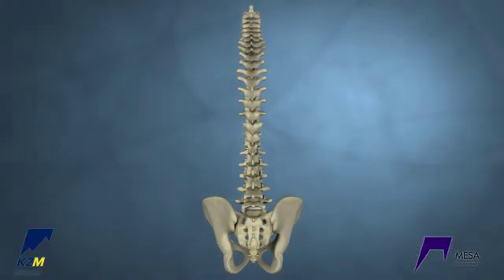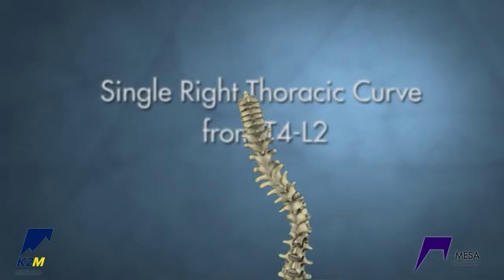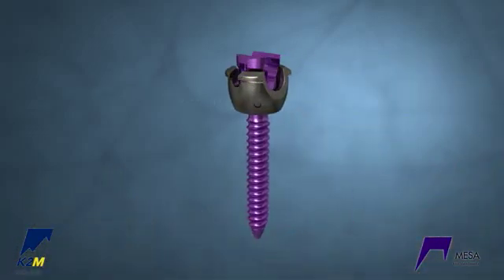This module demonstrates a right thoracic curve correction using a single rail correction technique. This correction technique features the MESA Deformity Spinal System.